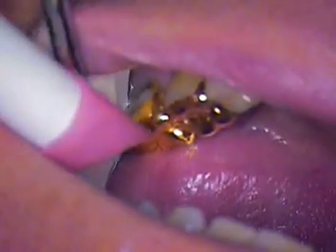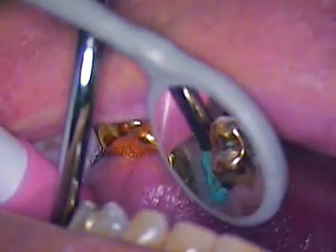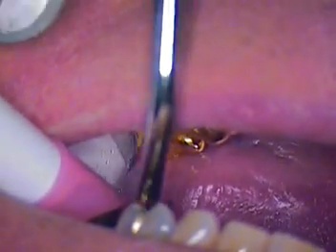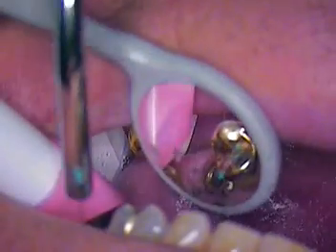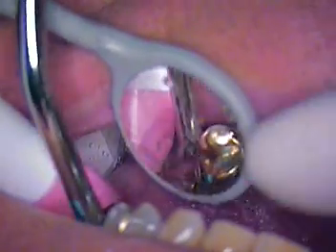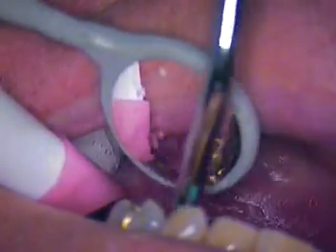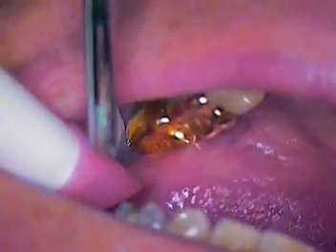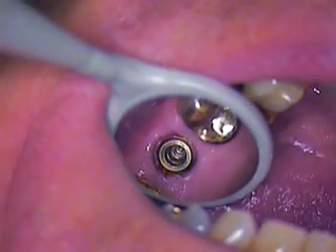All right, we're going to go ahead and rinse that off. And a little on the bicuspid there. Great. All right, looks good. All right, great.